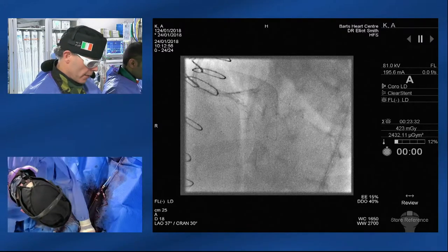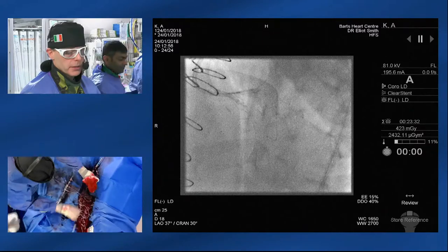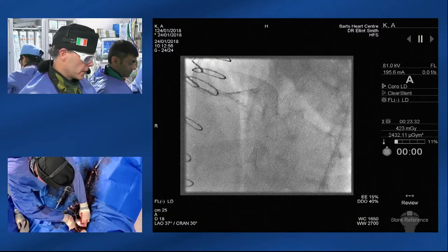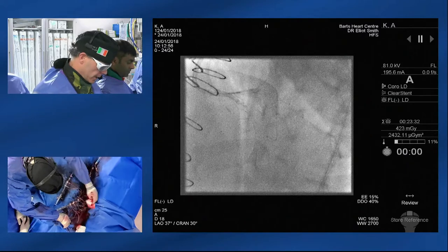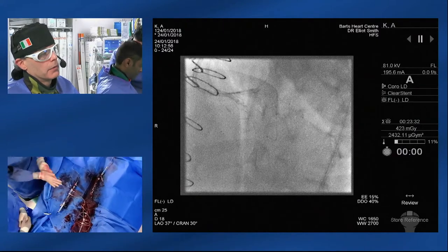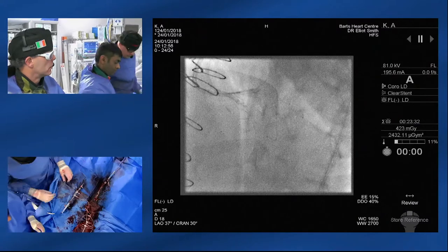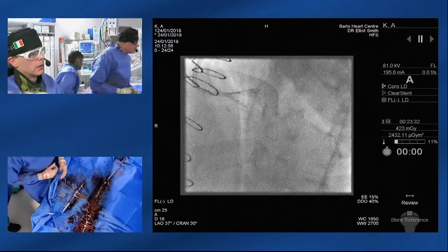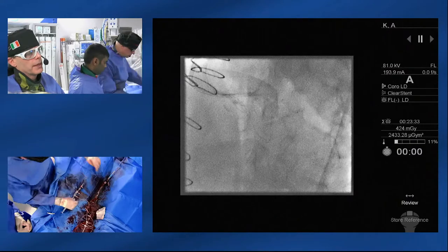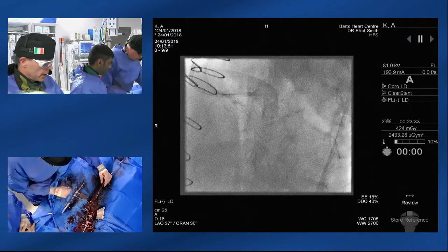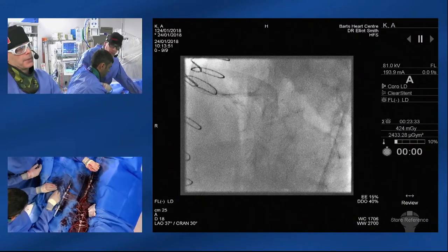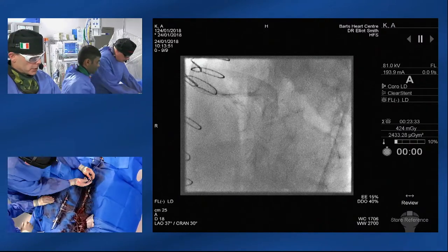That's almost always true. It depends on the mismatch between antegrade and retrograde. The only area where it doesn't matter if you take a bigger balloon is where your antegrade wire is in the sub-intimal space and your retrograde wire is in plaque — because you just create a very large sub-intimal space and don't create the communication. Let's have a look at Elliot doing the externalization. Our externalization system is now in the diagonal branch and we need to get a wire in the LAD — so how are we going to solve that?